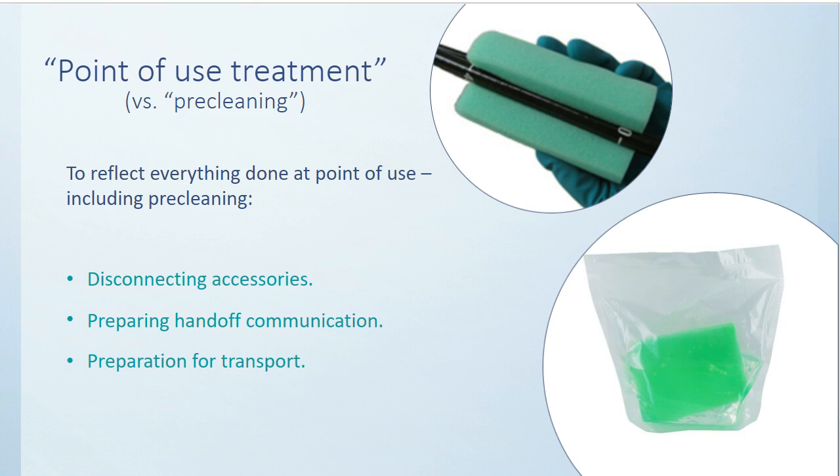Pre-cleaning always occurs. And time is critical, and this is emphasized multiple times within the document. We need to limit bioburden before it has a chance to dry. Also, biofilm only takes minutes to develop. IFUs and guidelines call for the use of non-linting cloths or sponges to be used in point-of-use treatment pre-cleaning. And then we emphasize the need for handoff communication from point of use to the decontamination area, and that minimally should include patient identifier, date of procedure, and time that point of use treatment was completed.